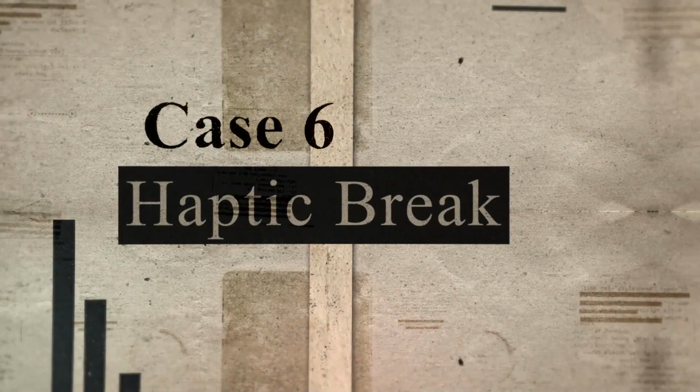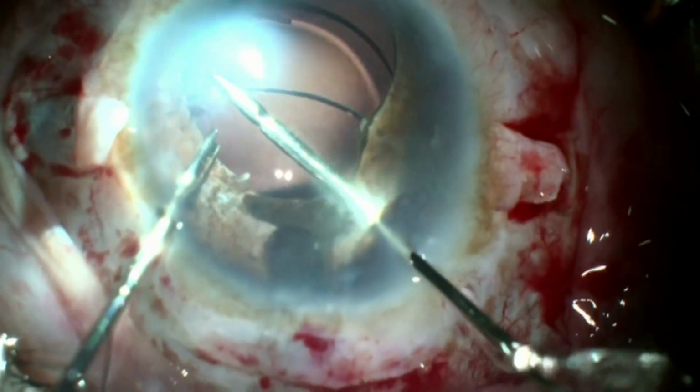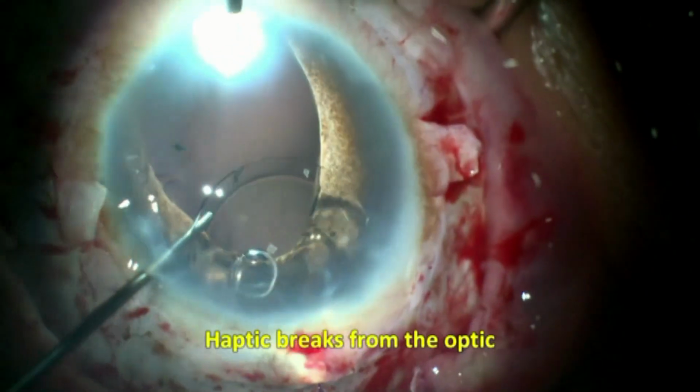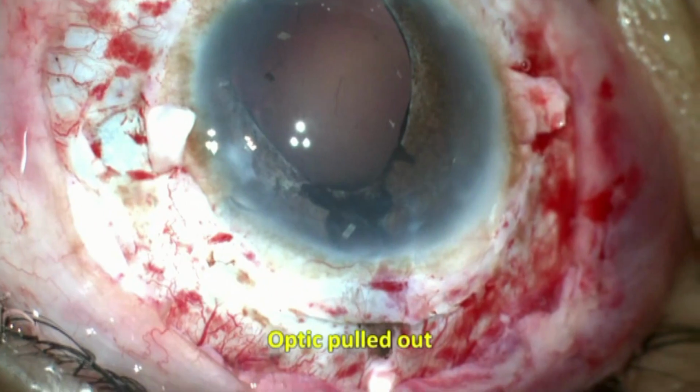In this case of glued IOL, where the haptic of the 3-piece IOL broke, ENDOILLUMINATOR comes to the rescue and helps in finding the broken end of the haptic and safely explanting the haptic and damaged 3-piece IOL out of the eye.